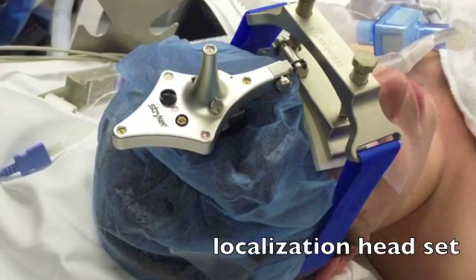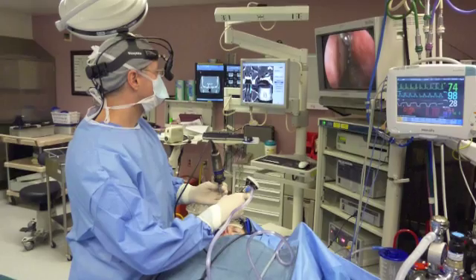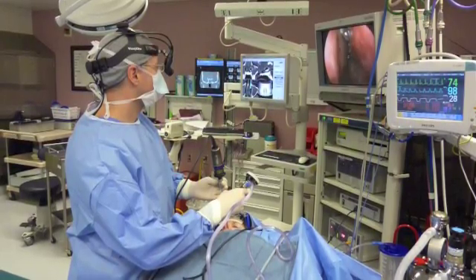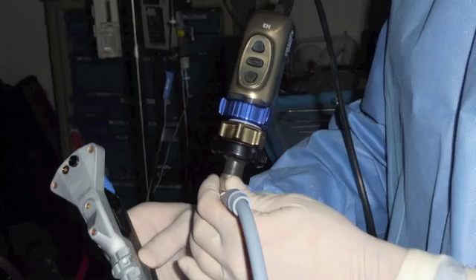A localization headset lets us register the patient to the localization system, and here we see the setup for the room.